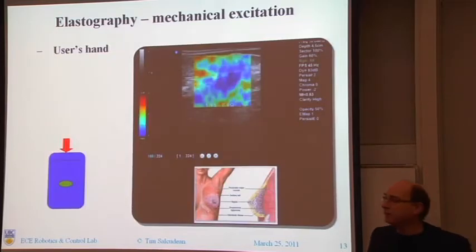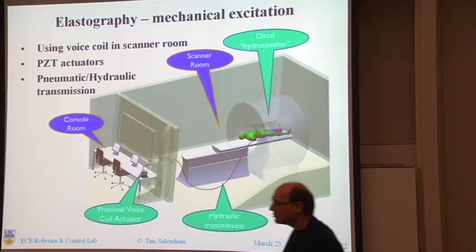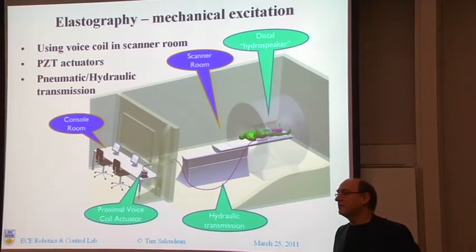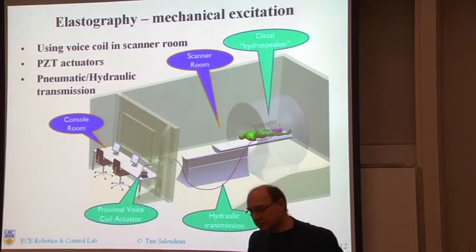Question. It would seem to me that what you get depends enormously on what frequency you're driving the system at. Absolutely. And it seems to me all of these methods are way too high a frequency to really get at tissue differences. It would seem to me that tissues at high frequencies all behave roughly the same because it's dominated by the fluid that they're in.